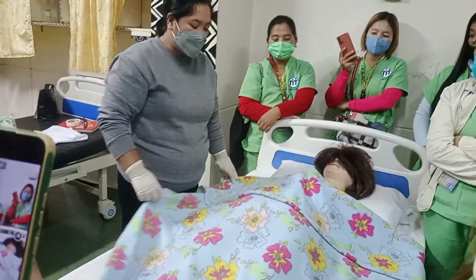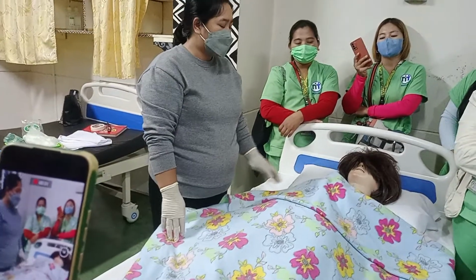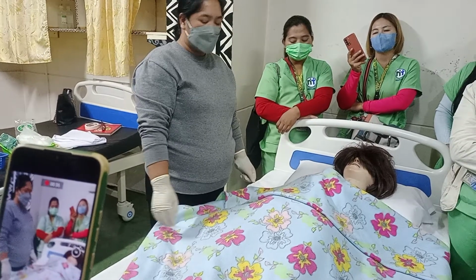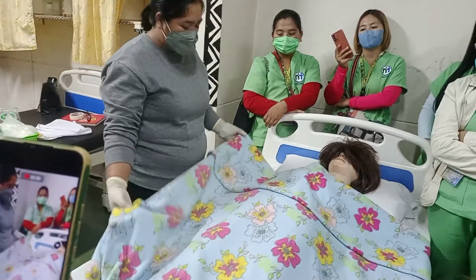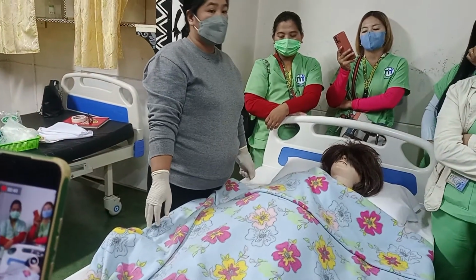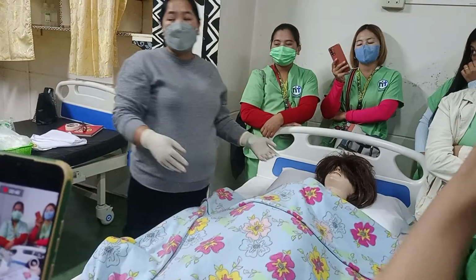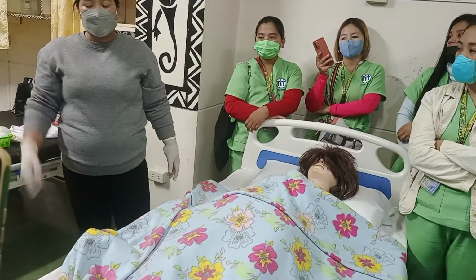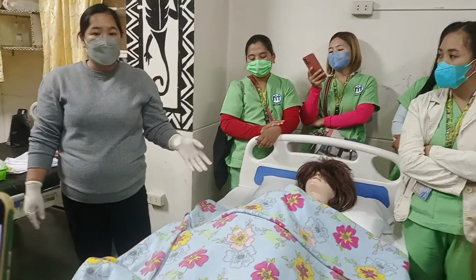If you feel anything like there's pain or discomfort after we insert, and you observe that later on, here's the call light. Please press the call light and I will come in, deal with your needs and of course with your complaints. Pakiobserbahan po natin ang sarili natin. Alright, after that, you go out, raise the side rails if it is ordered or pag nakikita niyo kailangan ng pasyente, basta binigay ang call light.